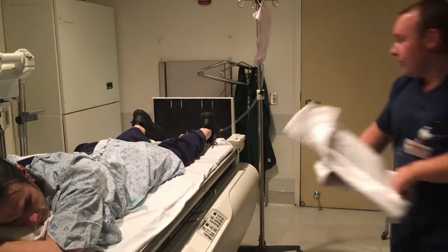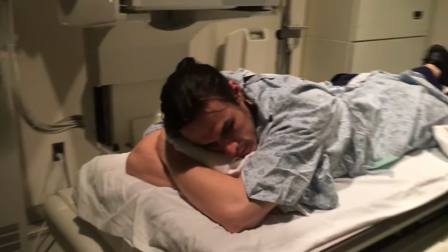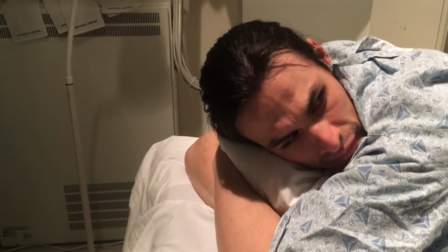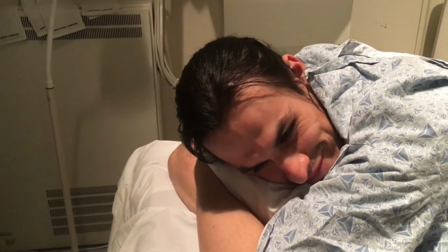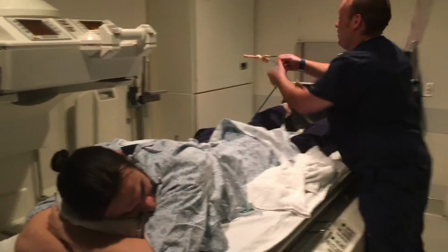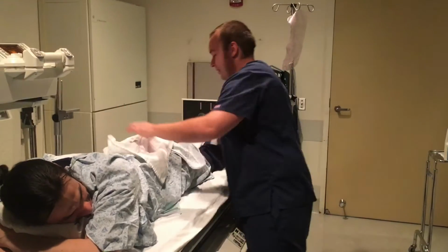Alright. So what I'm going to do, sir, I'm going to pull this tip out. I'm going to have you wrap this towel under you, and you're going to waddle to the bathroom so nothing drips out. Alright. Yeah, there we go. Sorry, I had to do one quick pull. Bad day. There you go.